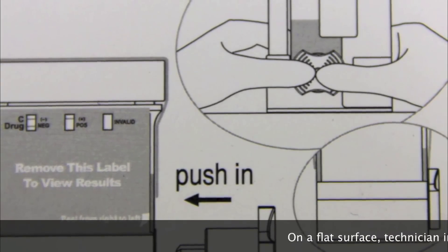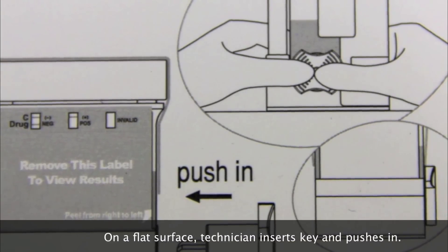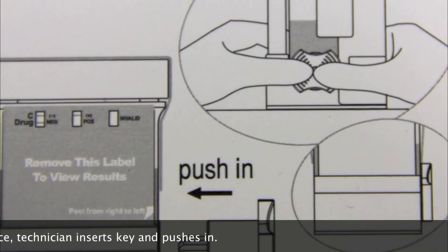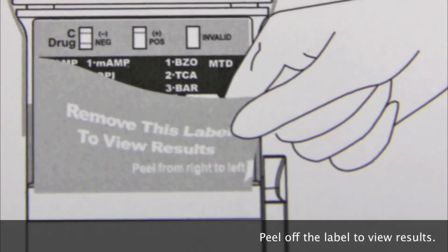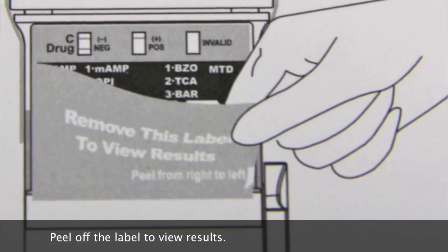On a flat steady surface, the technician inserts the key and pushes inward. Be sure to peel off the label on the front of the test to reveal the results.